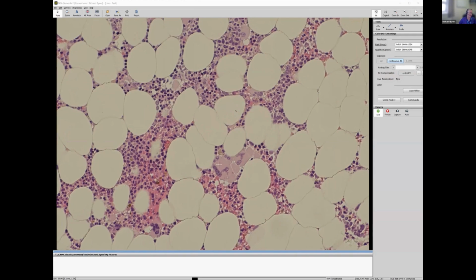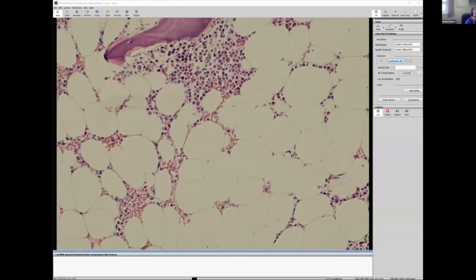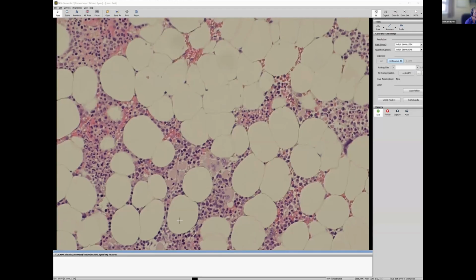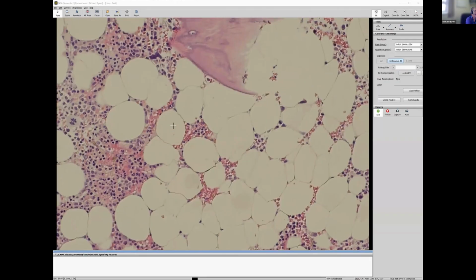You might get 1 or 2 clustering together, but here you've got at least 3 and maybe 4 clustering together. That's a very atypical megakaryocyte there as well. So when you're assessing whether myelofibrosis is persistent, then really you're looking at the megakaryocytic abnormalities. And everywhere we look, we're retaining these clusters of megakaryocytes there, there, there.